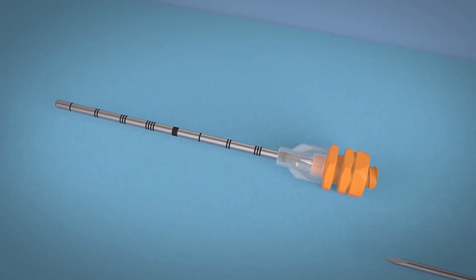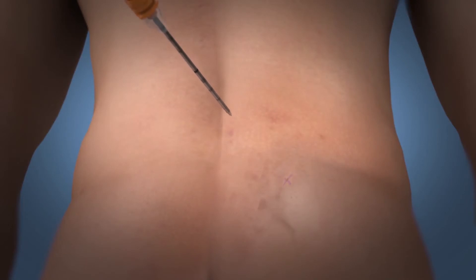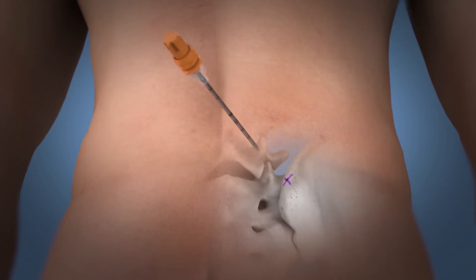Reinsert the stylet into the cannula and tighten to ensure the stylet is fully seated. Manually insert the needle into the prior skin insertion site to the level of periosteum, slightly redirecting the needle to an adjacent location of the previous insertion site.